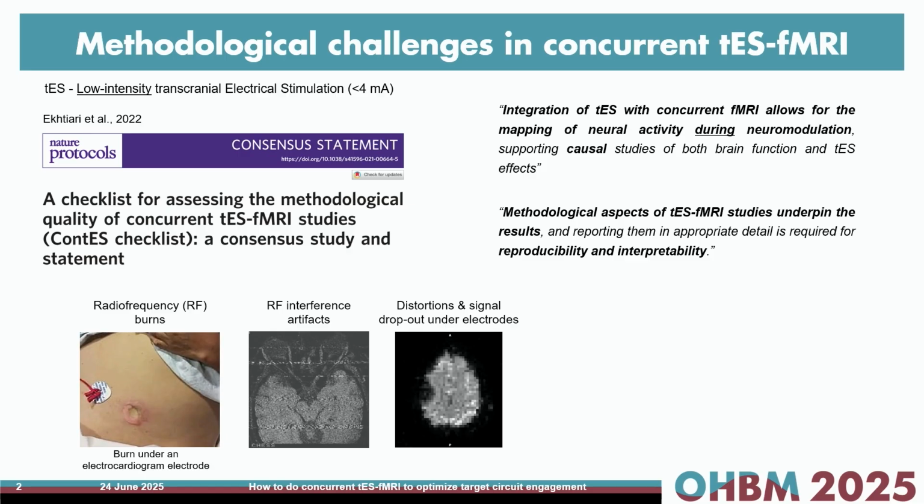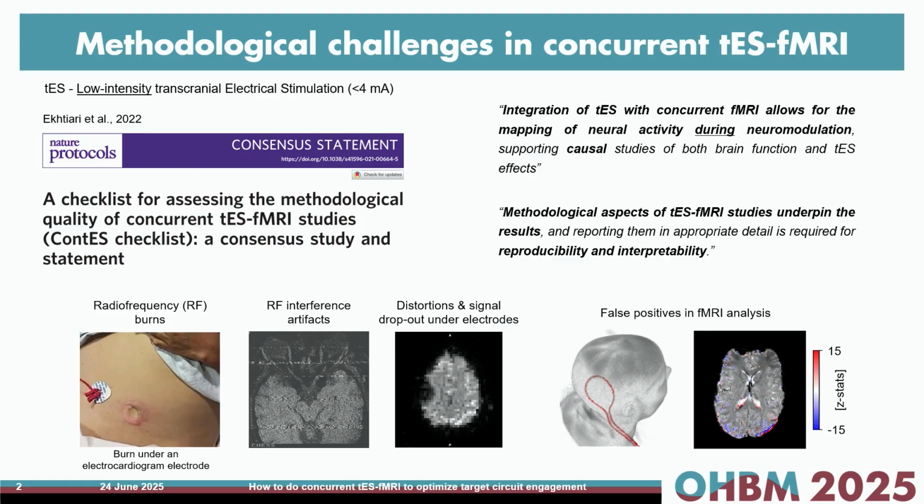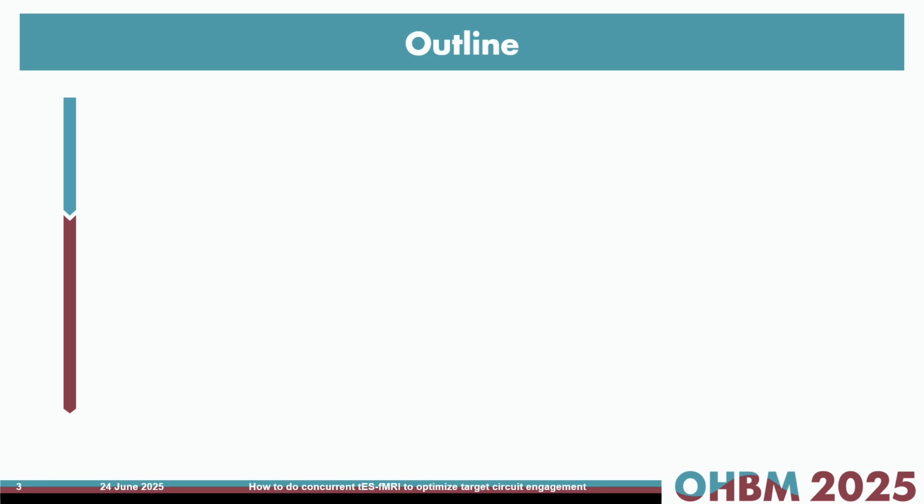But even if you follow all these recommendations, you don't have safety issues, and your images look nice, you may still have not so obvious artifacts in your data that can cause false positives in your fMRI analysis. So my talk will be divided into two main parts.